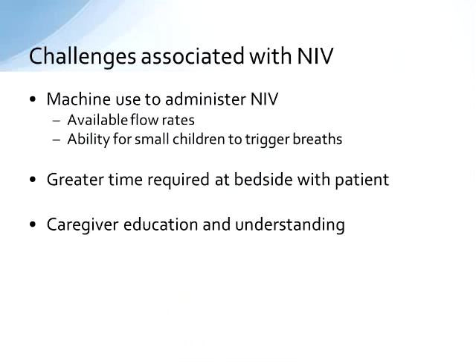It can be a challenge to find a unit, a machine to deliver the non-invasive ventilation that has flow rates that are appropriate for a small child. You don't want to blow them out of the water with big bad flow rates. But in contrast, it also has to be something that the child can trigger. So it has to be sensitive enough that a small baby or toddler-aged child can trigger the device without auto-triggering continuously. So it's a delicate balance to walk.